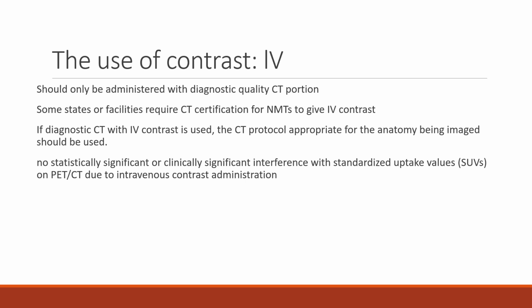If diagnostic CT with IV contrast is used, then the CT protocol appropriate for the anatomy being imaged should also be used. And there's no statistically significant or clinically significant interference with standardized uptake values with contrast on PET.